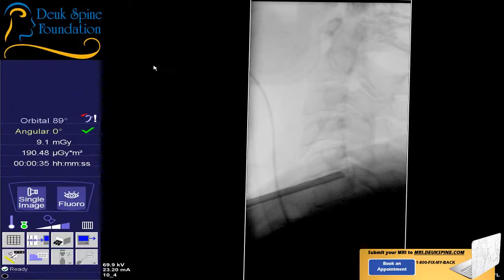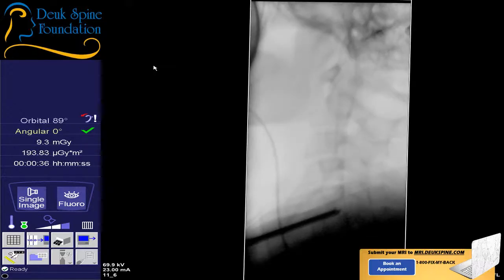Okay, so when you're ready, let's get an x-ray. Everybody's ready? Go. Okay, what was that? I think one of the arms, the wrist restraints, just pulled. You don't want to look underneath you, I'm behind you. Take your time. You've got to watch. Do not let them contaminate the sterile field. Check her wrist restraint.